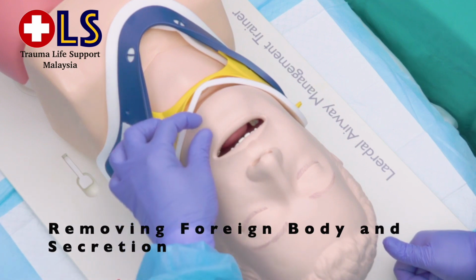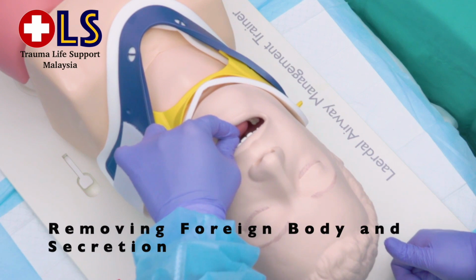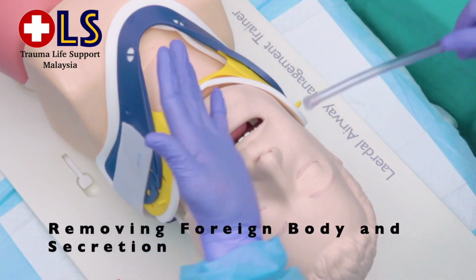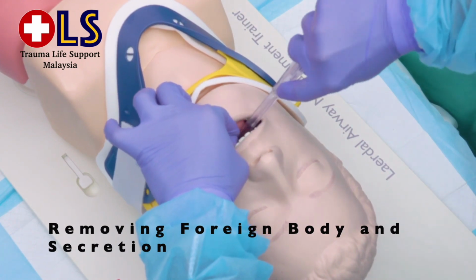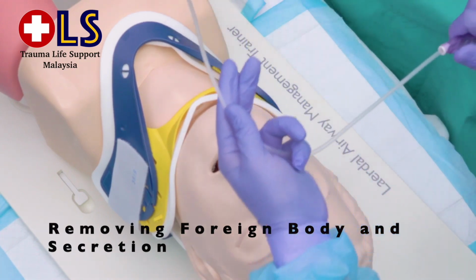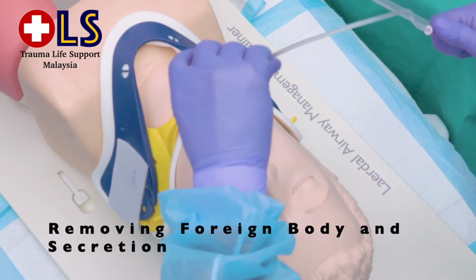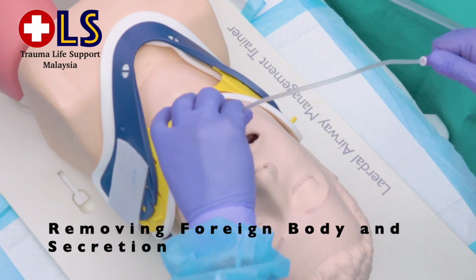Once the airway is open, look for any foreign bodies. If it is a hard object, remove it with a Magill Forceps. If it's secretion, we will do suction. Suction is functioning in your airway. Suction. For pediatric patients, we will be using a soft suction. So insert this, then suction. Insert it again until the maximum that you can go. Suction.